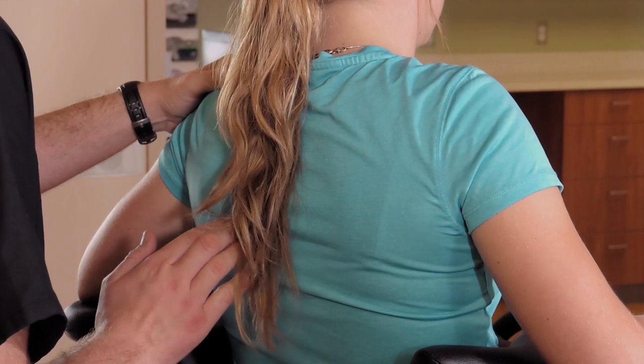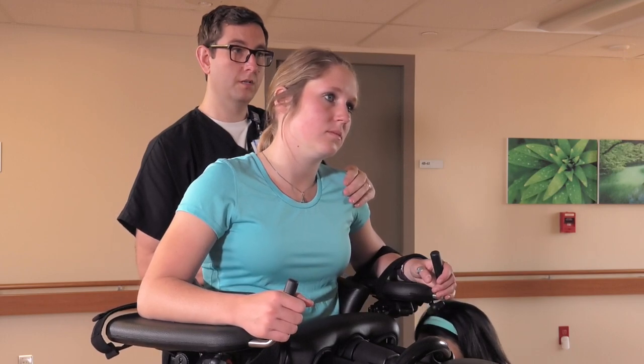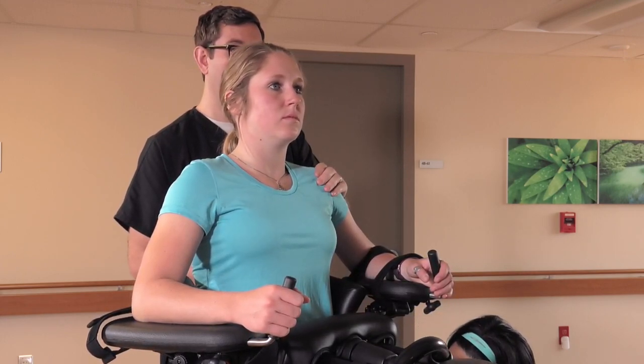Cue the patient to push through her forearms, lift her head high, and bring her shoulders back. Encourage the patient to make eye contact with herself in the mirror and avoid looking at the floor.